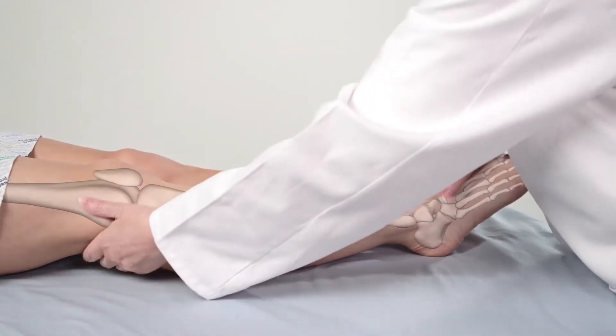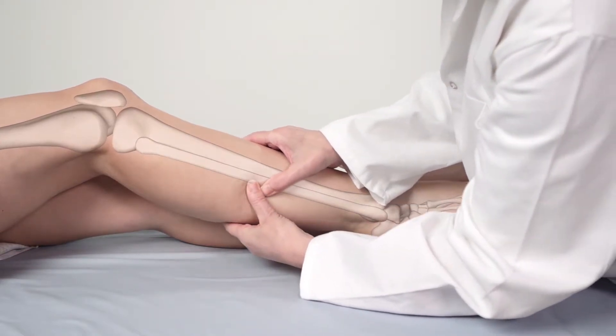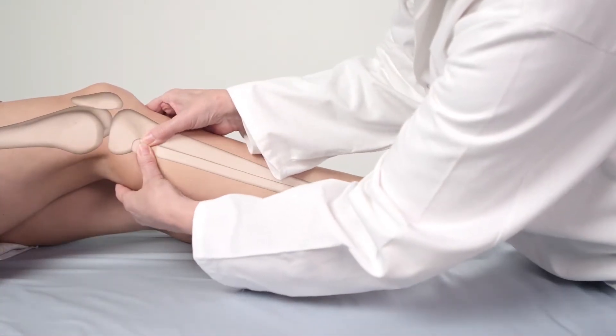Alternatively, locate the fibular head by placing your fingers on the ankle bone on the outside of the leg, and in the groove between the calf muscles and the muscles at the front of the leg, run your fingers upwards towards the knee until you feel the round protrusion at the top of the fibular bone — the fibular head.